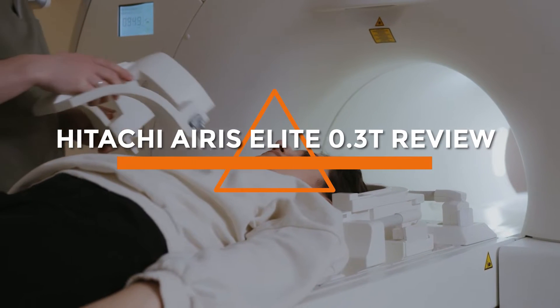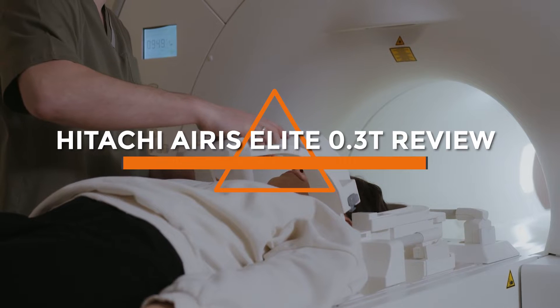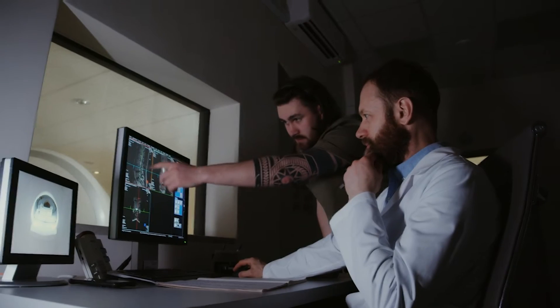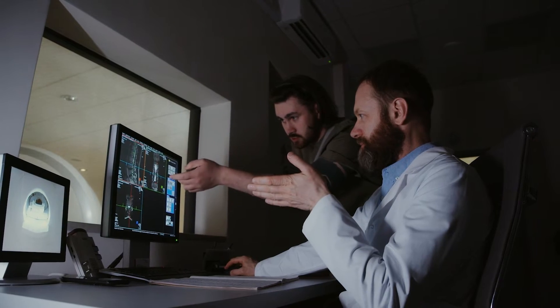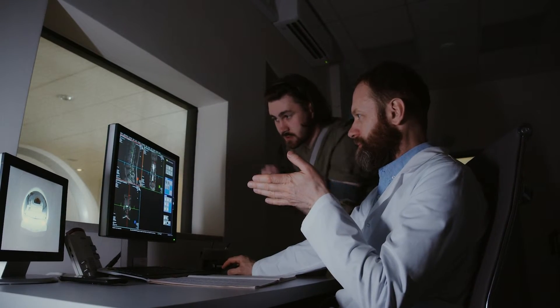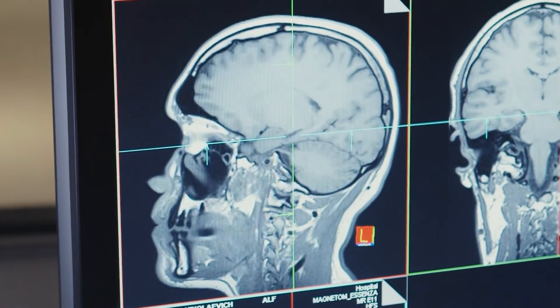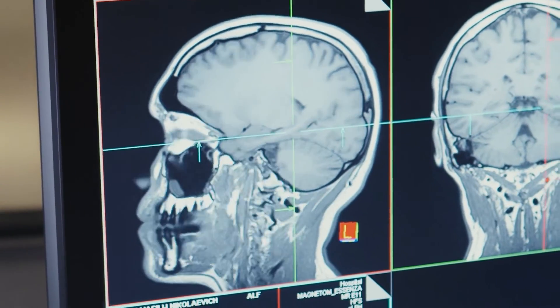Welcome to today's video where we'll be reviewing the Hitachi Airis Elite 0.3T MRI machine. The Airis Elite 0.3T is a low-field MRI machine that's ideal for orthopedic imaging, neurology, and general imaging. Let's dive in and explore the features, specifications, and pros and cons of this machine.